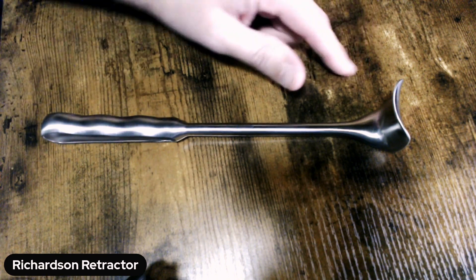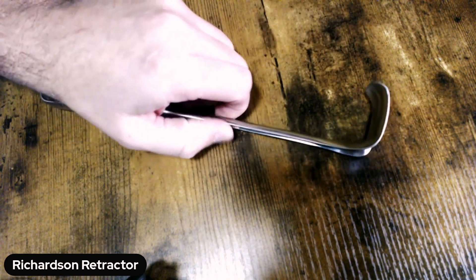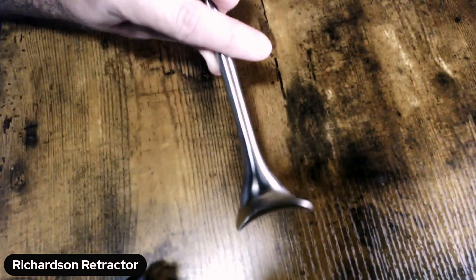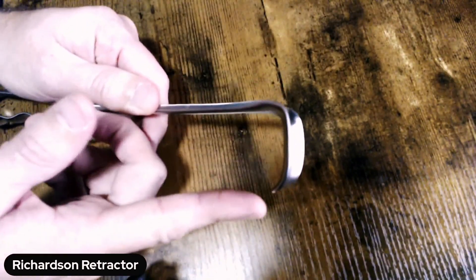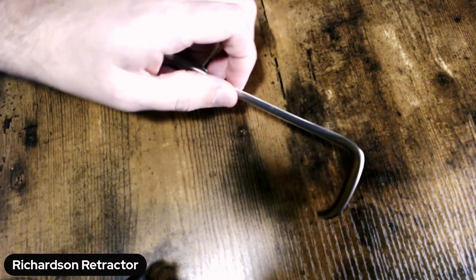It has a blade — in this case, kind of a square blade because it's got the same dimensions. It's an inch and a half deep, and that's how we're measuring depth. And then it's an inch and a half wide — that's across the blade itself.